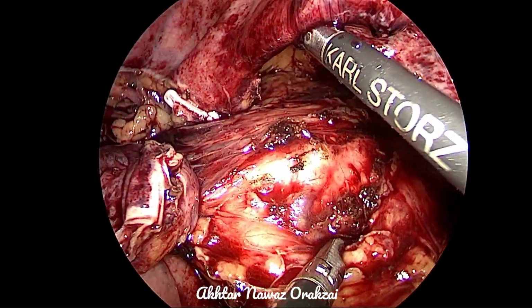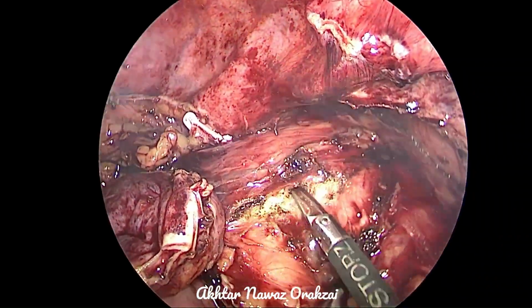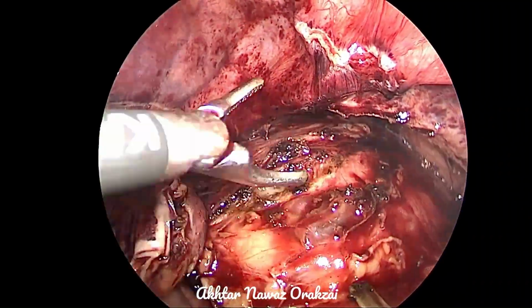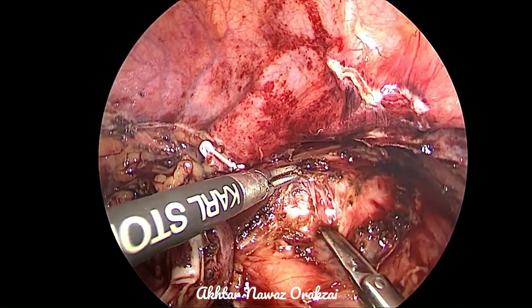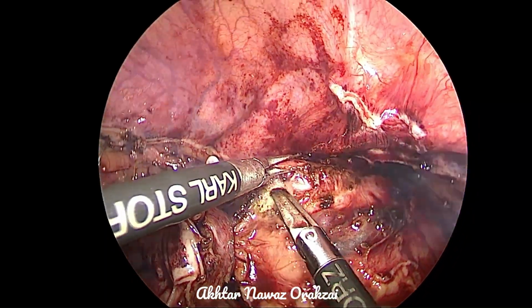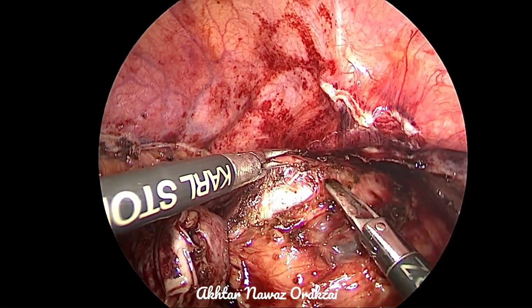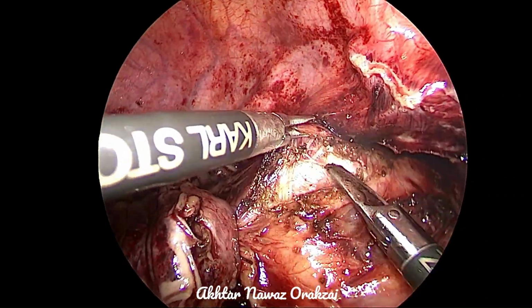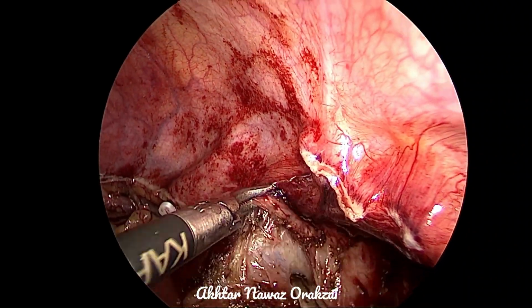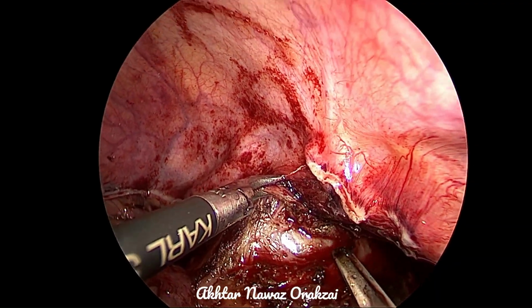Now the bladder is full. Remember, it should not be overfilled, because if it is overfilled, a slight rent in the bladder wall will make the mucosa vulnerable to open. So it should not be completely empty, and it should not be completely filled. It should be half filled, so that the structures can be identified, the muscle can be easily dissected from the mucosa. This is detrusor muscle, and the blue color of the mucosa is now visible.